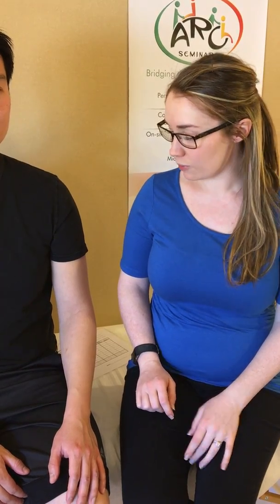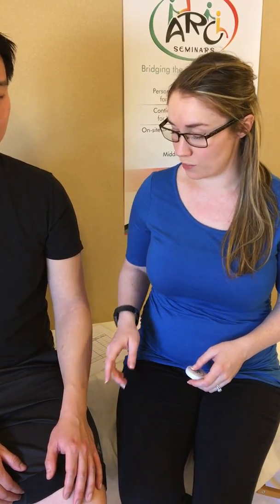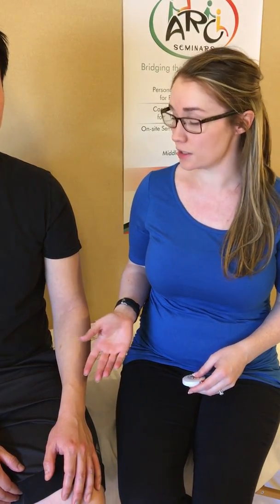Today I'm going to be showing you how to measure an upper extremity girth in order to track changes if you're treating your patient for upper extremity oedema, and to measure for a compression garment as your patient needs it.